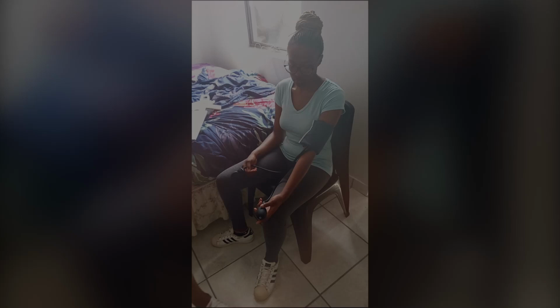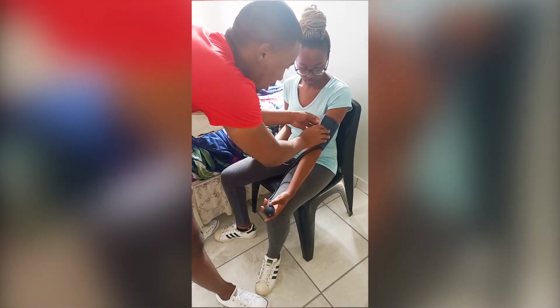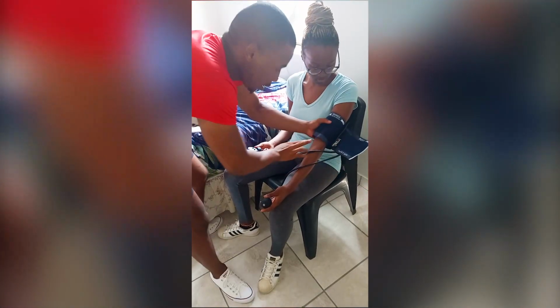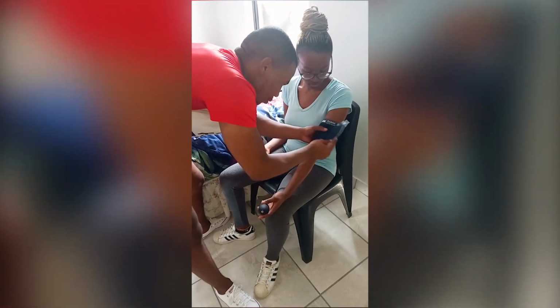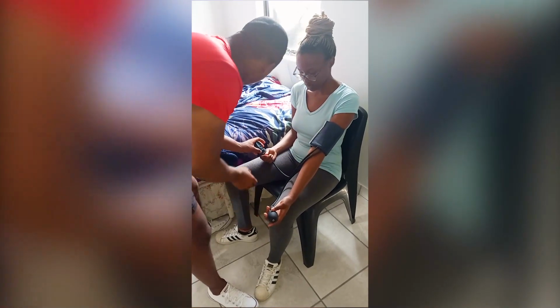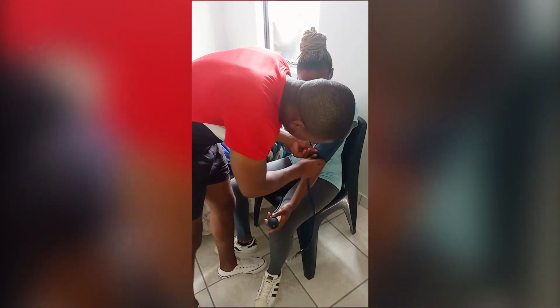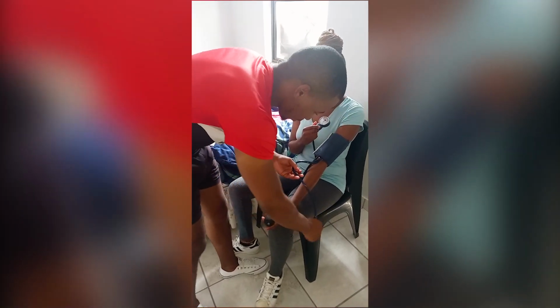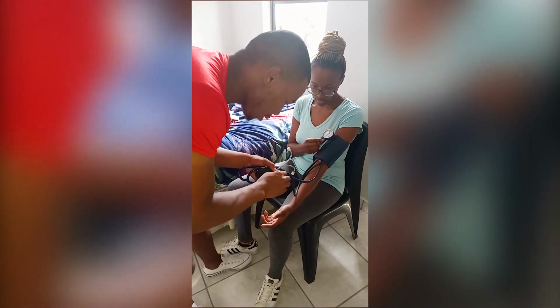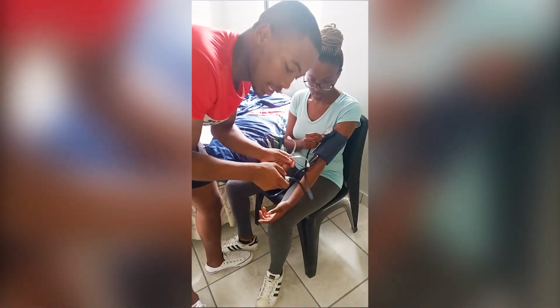Now we will check my client's blood pressure. First we will check that the cuff is not too tight. Let's make it less tight. Try to find the pulse and make sure you line up here, with the pulse here. Then you tap this underneath where you find the pulse. Make sure you close the valve here so that there is no air coming out. We will pump to 200 and then we will release some air slowly.